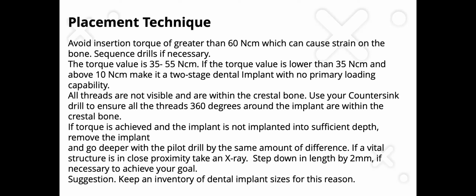Something I do when I feel like I'm close to vital structures, I will take x-rays and see how much space I have. And then if it allows me to do so, I will go deeper by 2 millimeter segments to achieve my goal.